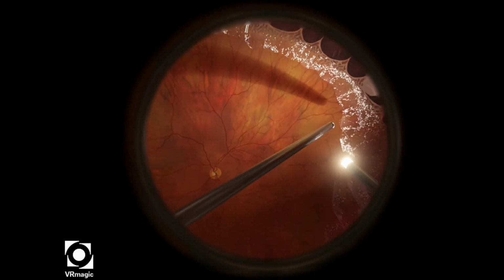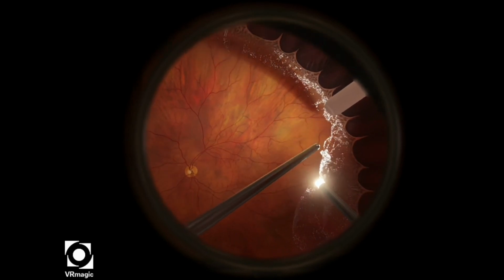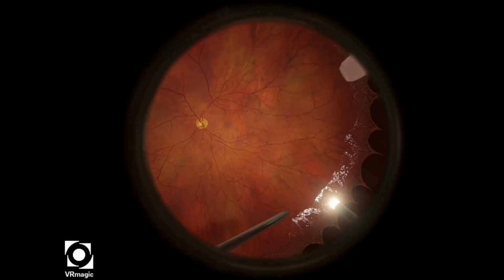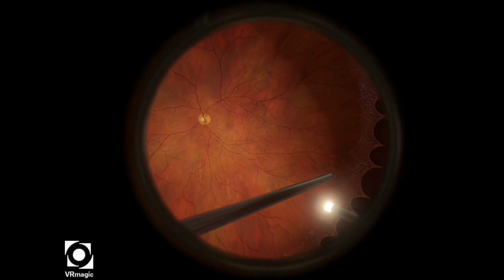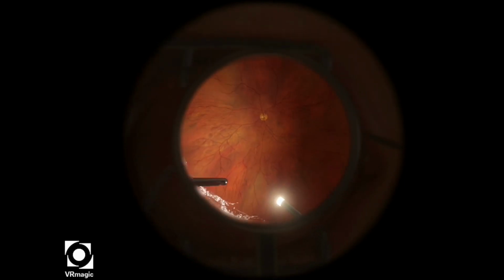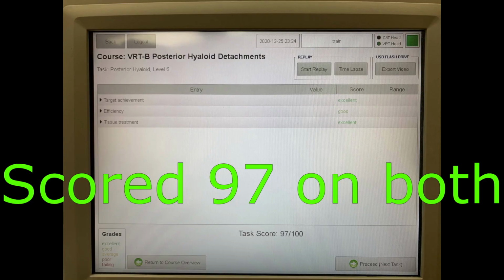So here I'm just gently cutting, again aspirating, and then lifting, and then cutting. And then again aspirating, lifting, and then cutting. So we scored 97 on both attempts.